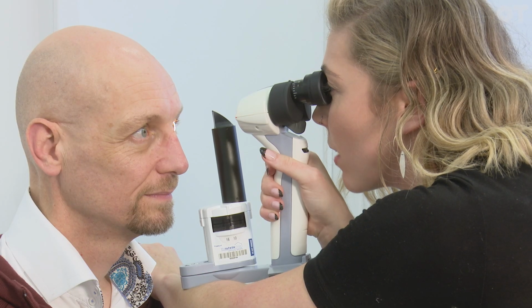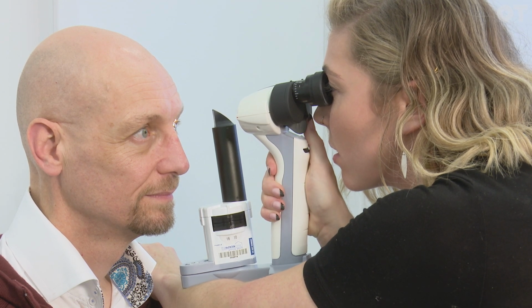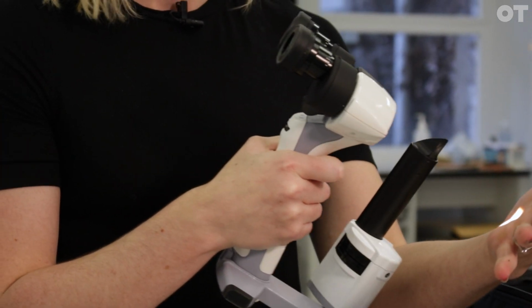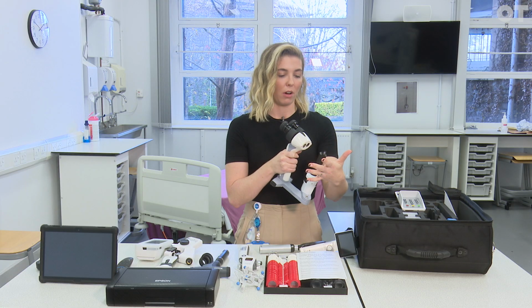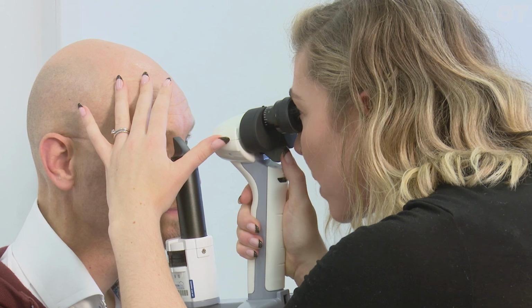We also have portable slit lamps. These are really useful for any anterior eye examination. A lot of our patients will have dry eye problems. Any anterior exam is really useful with this. They're dead simple to use, dead lightweight. We've had a few colleagues mention that they've sort of seen things like pseudoexfoliation, which you'd have no hope of seeing without it.